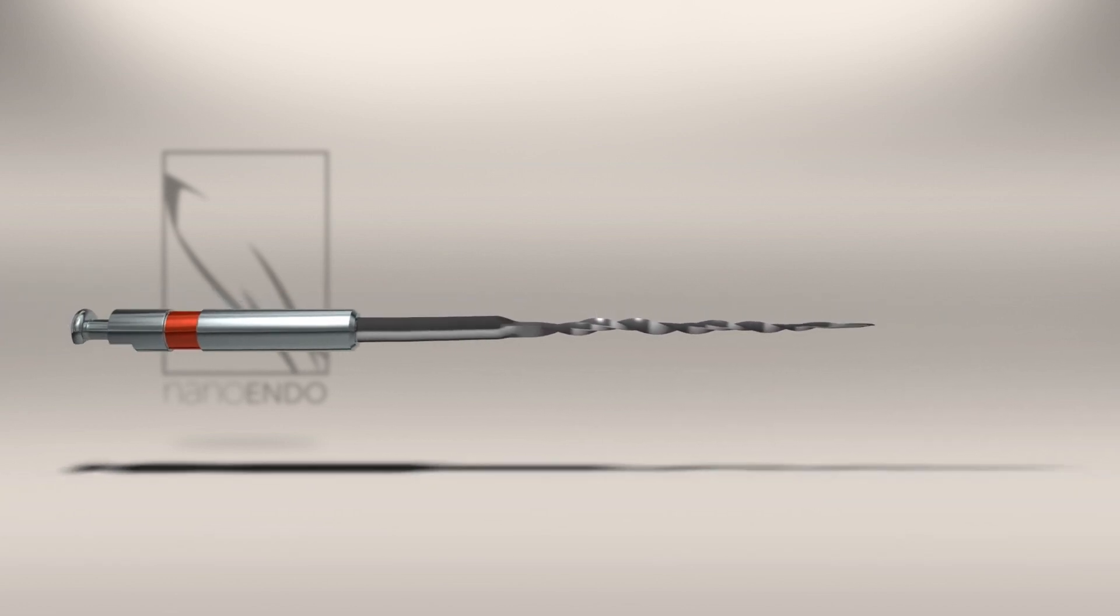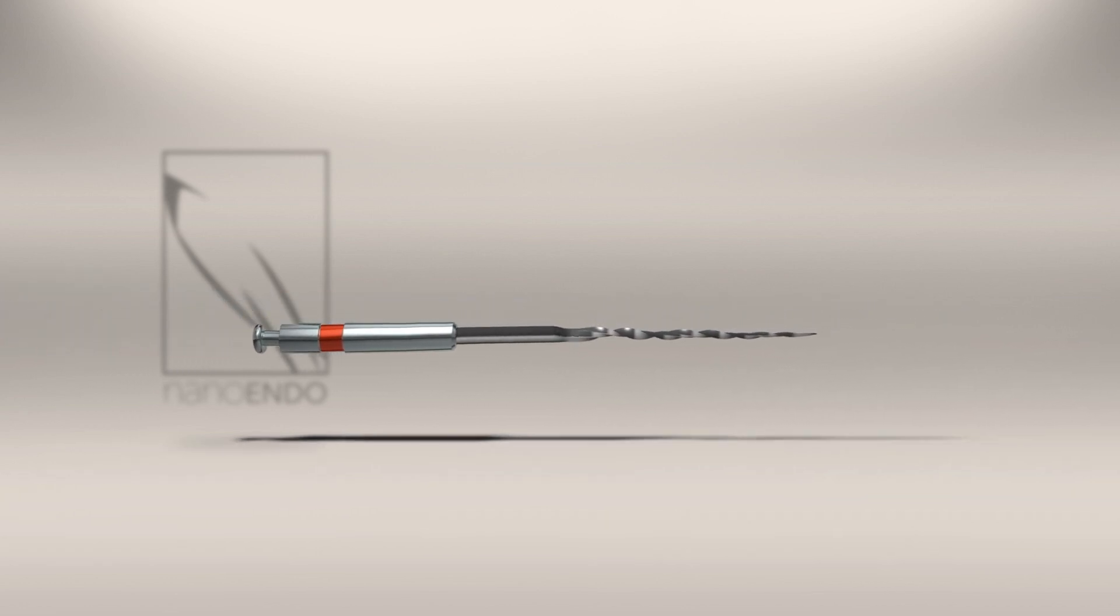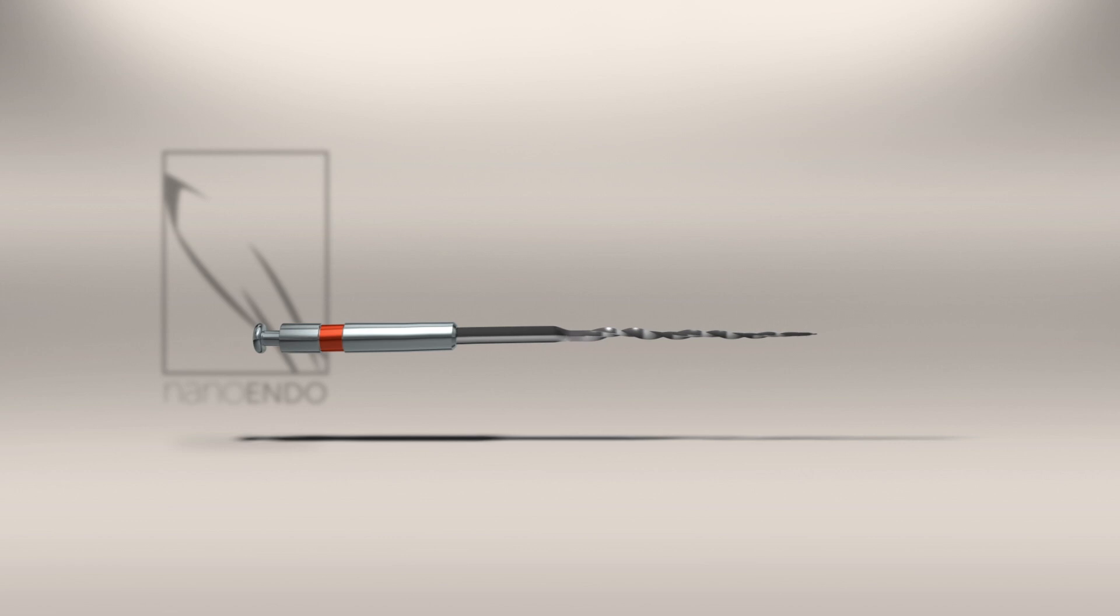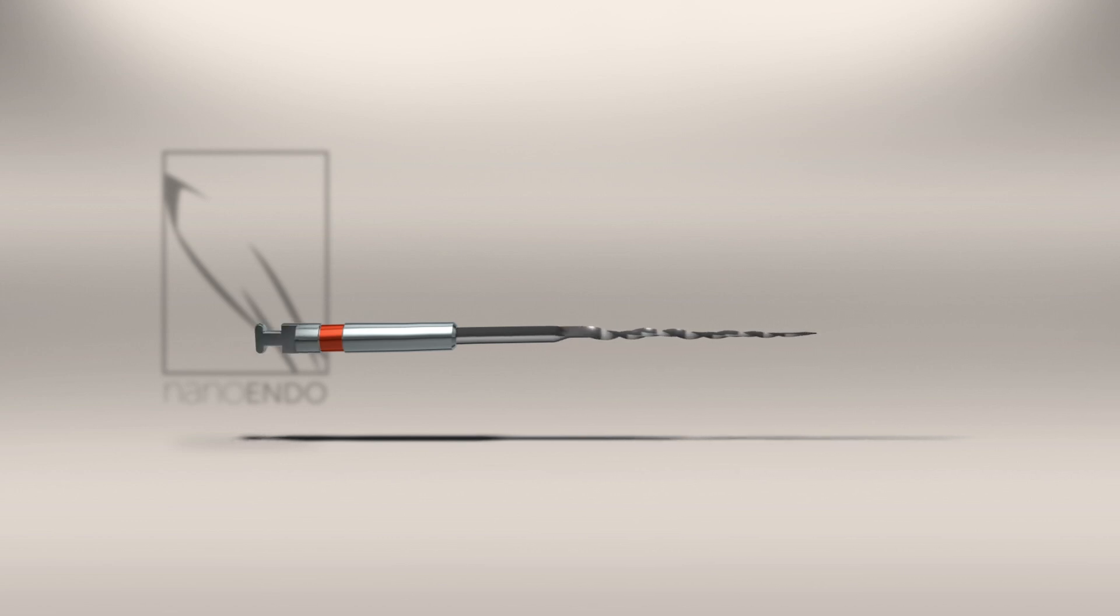The exoendo file is especially adaptable to conventional techniques, particularly those incorporating a brushing motion for enlarging the canal to a diameter greater than that of the file used.